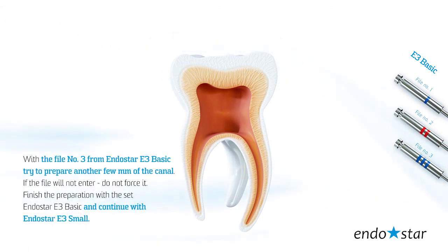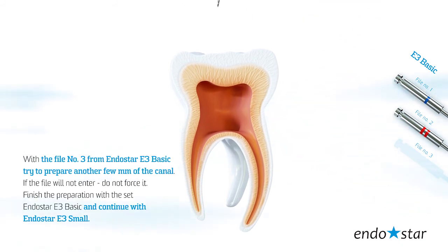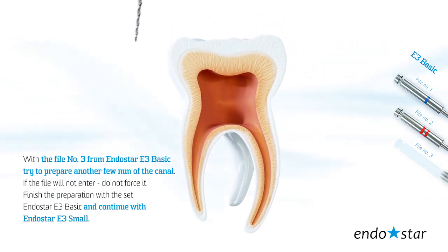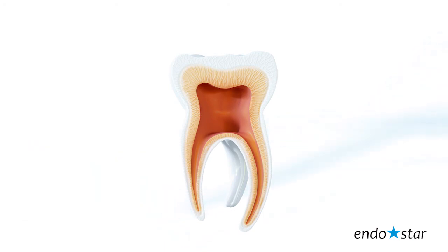With file number 3 from Endostar E3 Basic, try to prepare another few millimeters of the canal. If the file will not enter, do not force it. Finish the preparation with the Endostar E3 Basic set and continue with Endostar E3 Small.